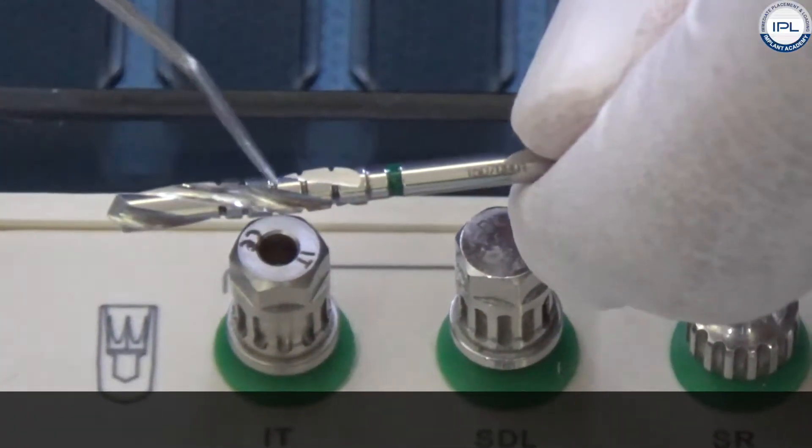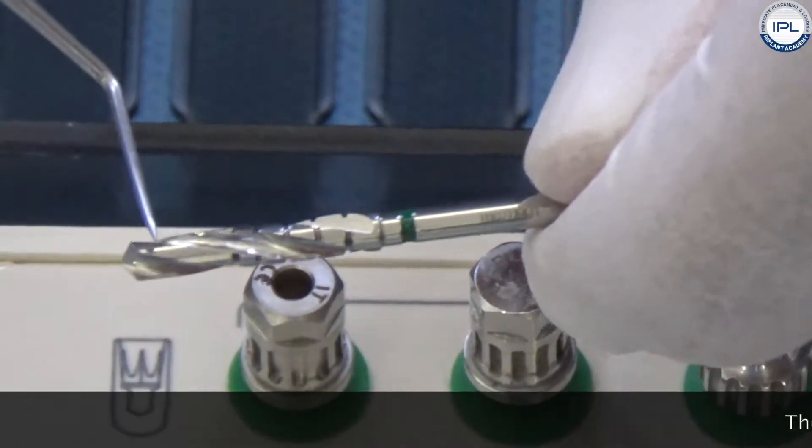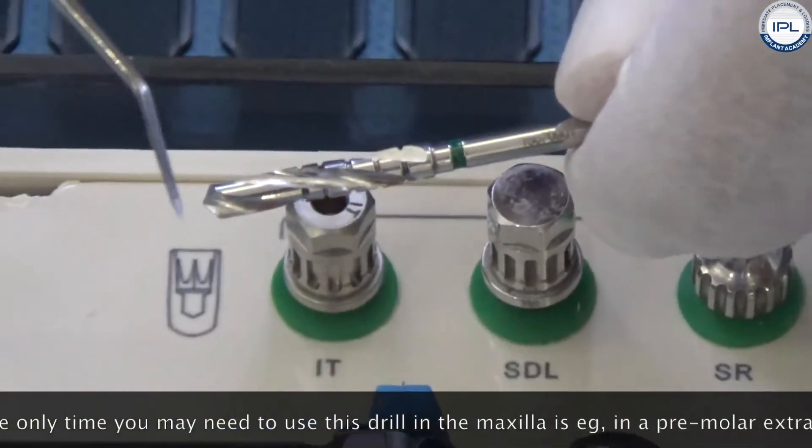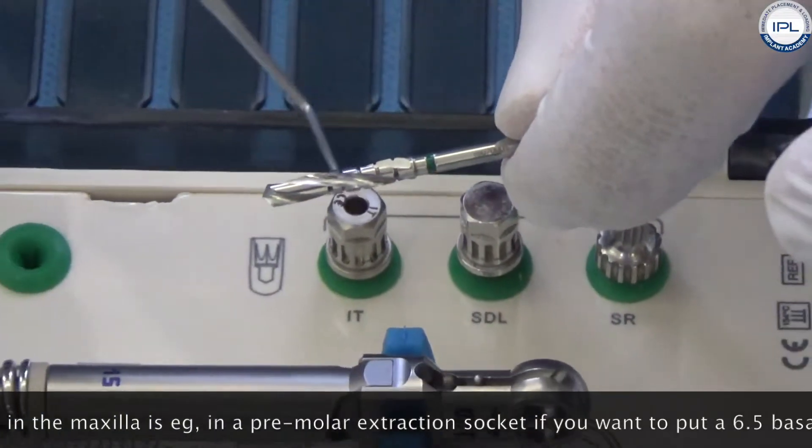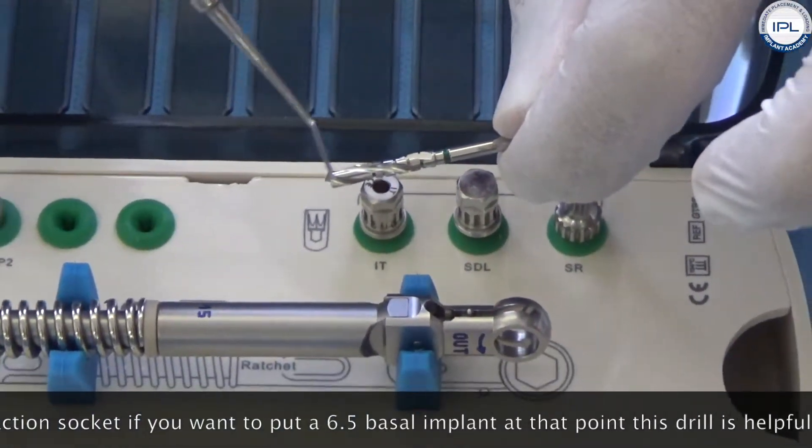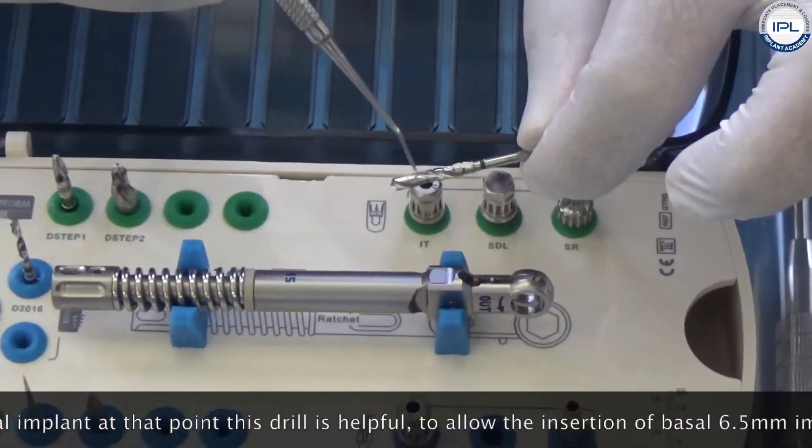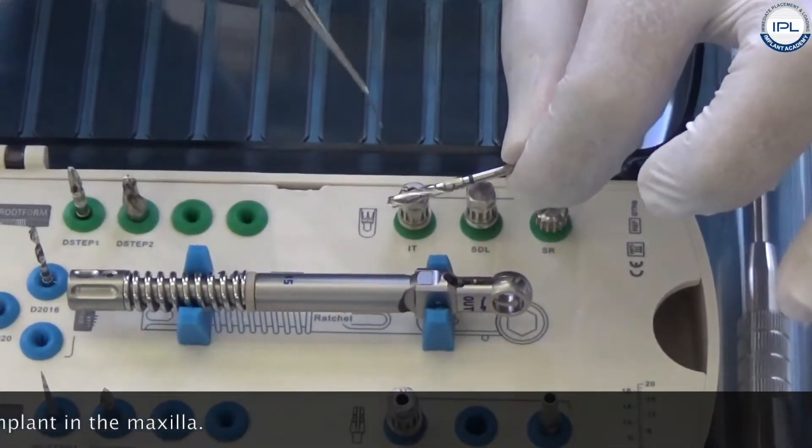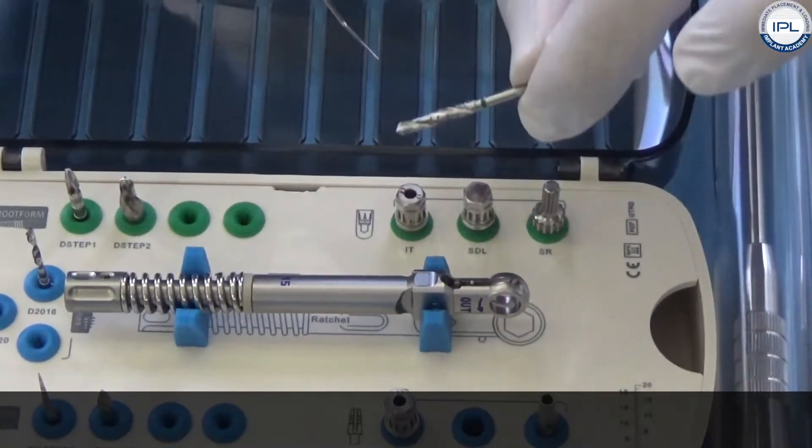You don't need to use this drill in the maxilla. The only time you may need to use this drill in the maxilla is for example in a premolar extraction socket if you want to put a 6.5 basal implant. At that point this drill is helpful to allow the insertion of the basal 6.5 implant in the maxilla.